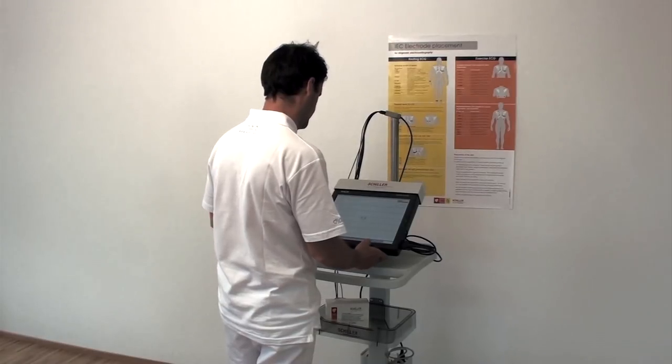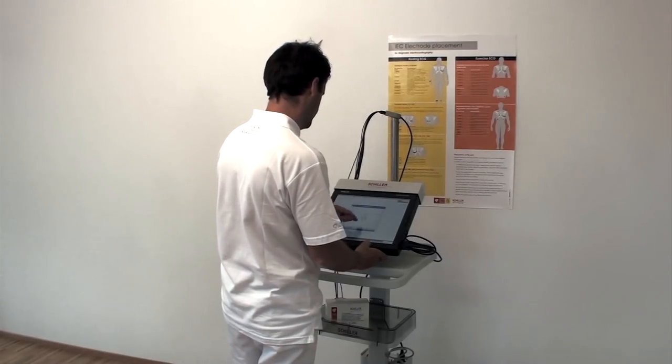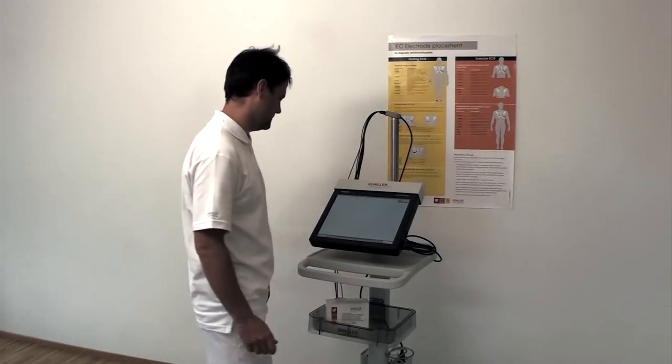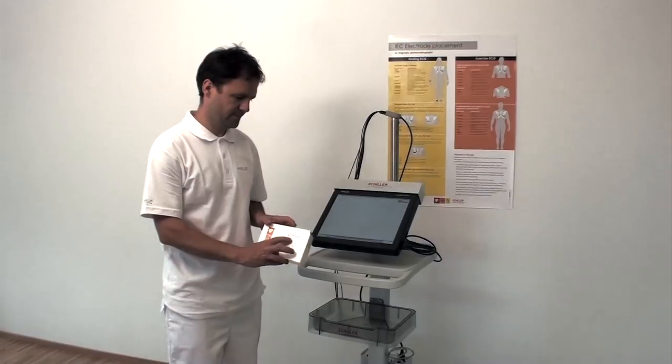In this instruction we will show you how to apply the electrodes for one of our resting ECGs, the MS 2015, in order to achieve a good electrical signal and ensure a successful recording.